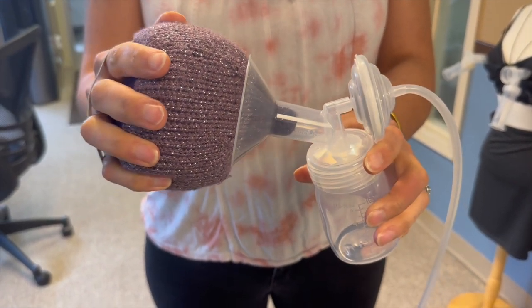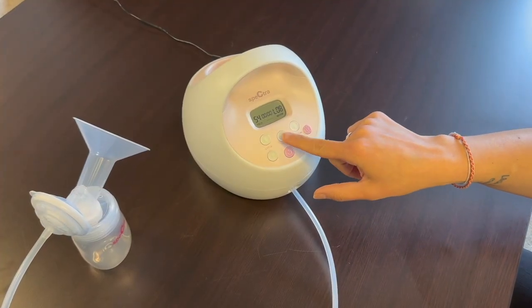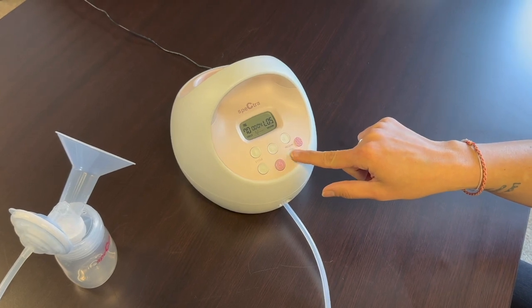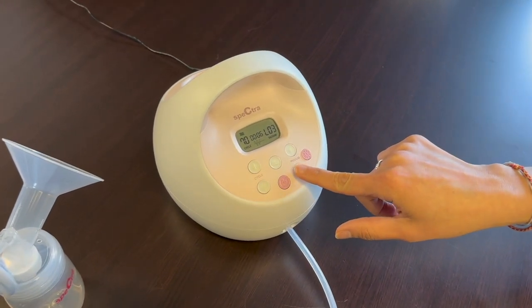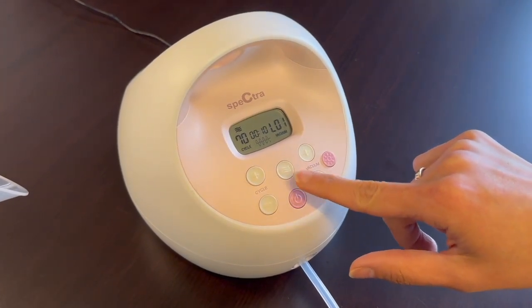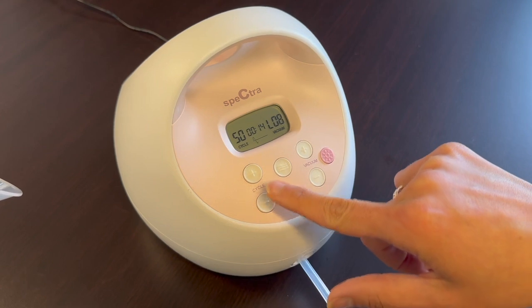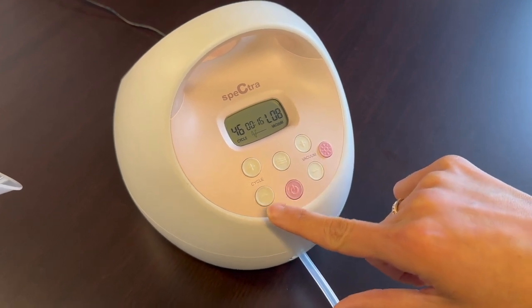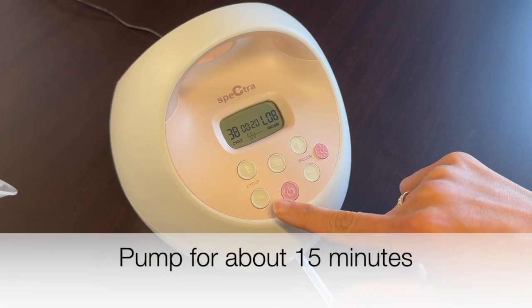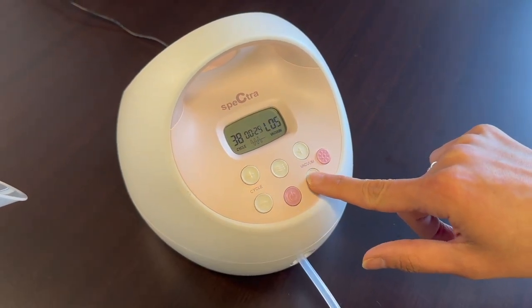Next you're going to center your nipple into the breast shield or flange. Turn the pump on then immediately hit the let-down button — the one with the squiggly lines. This puts the cycle at its fastest setting, 70 sucks per minute. Adjust the suction and once you see the milk flowing then hit the let-down button again to move it to the slower cycles. Pumping should be for about 15 minutes. Remember, if it hurts or you feel like you didn't drain your breast appropriately, you may need a different size breast shield.